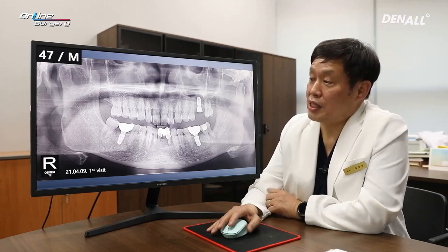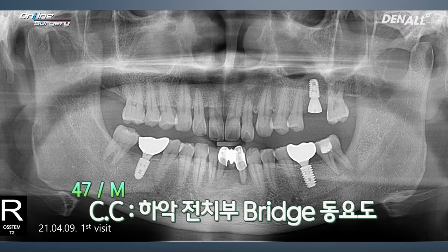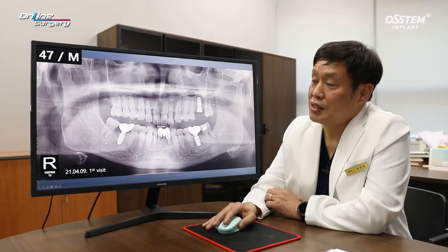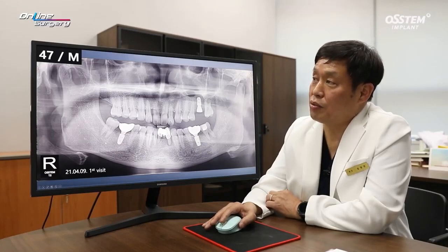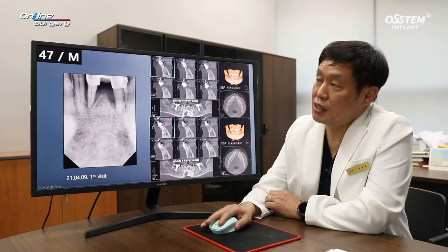This is the patient of the day, a 47-year-old male patient. If you look over here in the posterior area, implants are placed. In the lower anterior area, the current bridge has quite a lot of mobility. As the patient received implant treatment from a different dental clinic, he hesitated in treating this area. And this is the case for today.